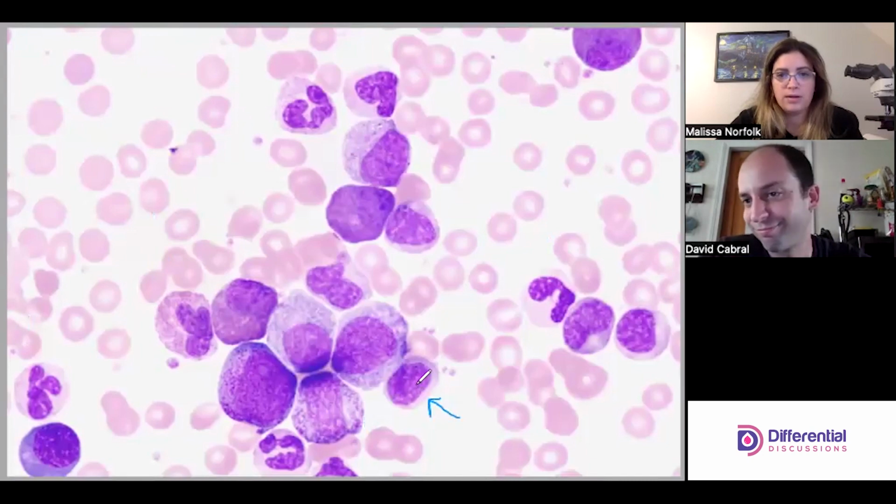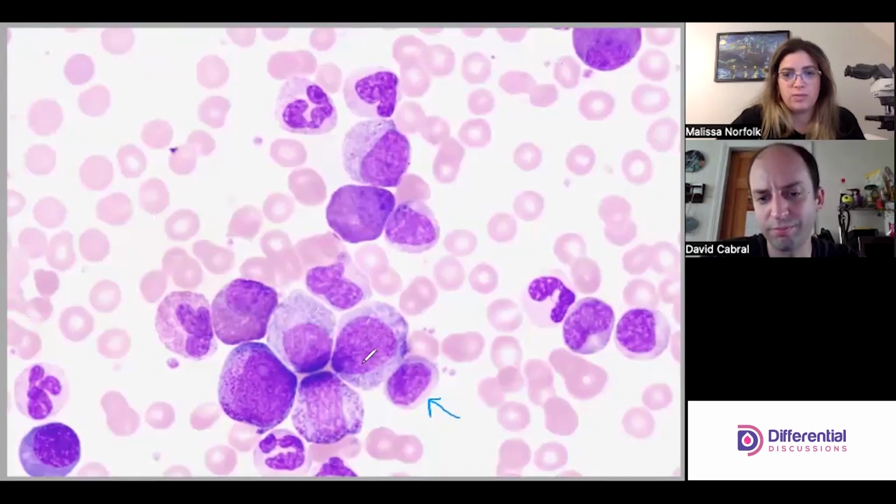I think meta. If you look, we're about the same for clumpiness in this, and more clumps. If they look similar, these two, in clumpiness to me. And then the other part is if you compare this to this, it's way clumpier. So we know it's not a pro. And also it's way clumpier than these guys. I know we haven't talked about these guys, but it's also clumpier than these. So I think the clumpiness is closest to this one.